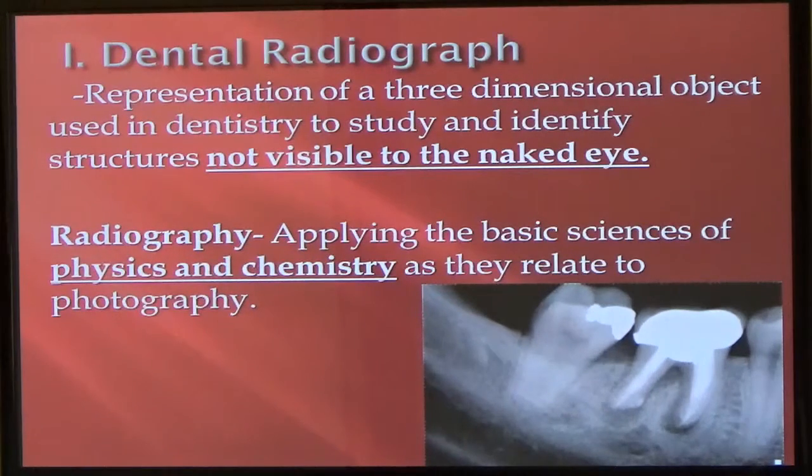So this is kind of what a radiograph would look like. You've got x-rays going through the tissues, hitting a plate or a sensor, and then you have an x-ray or a radiograph where we can see, we look in the mouth, we could see that this patient has, what's that? No, it's a filling. What class? 1, 2, 3, 4, 5, 6. 2. 2, correct. 2 surface interproximal between molars or premolars.